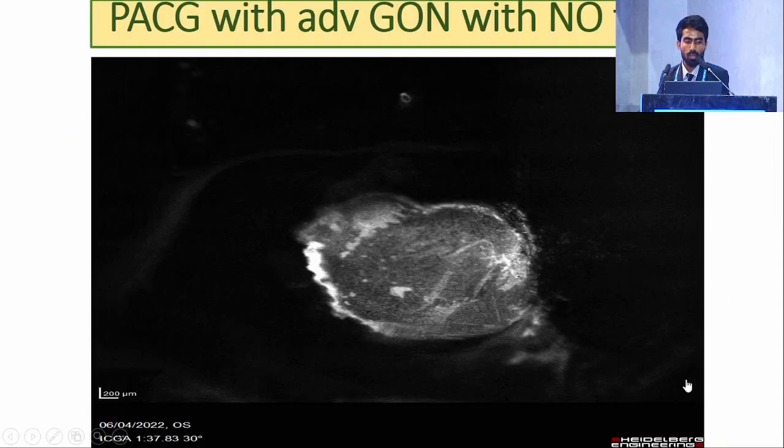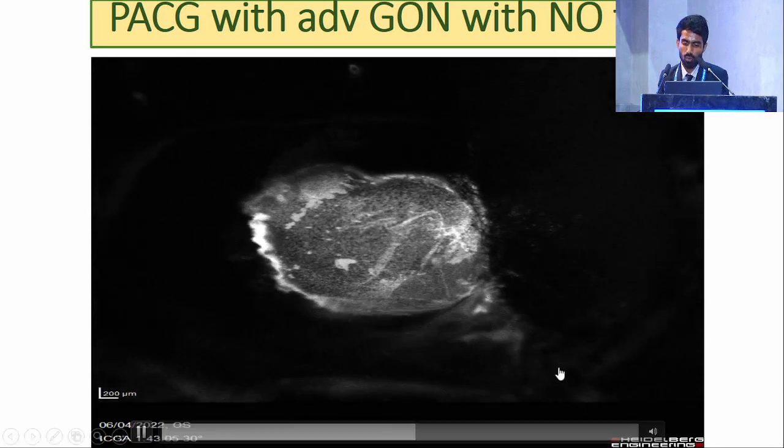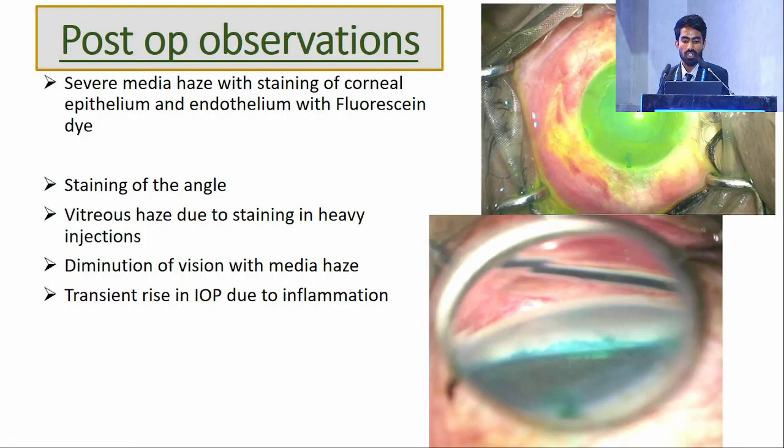This is a primary angle closure glaucoma patient with advanced glaucomatous optic neuropathy after ICG angiography. No aqueous channels are noted even at 1 to 2 minutes, and after injection of the dye, no aqueous channels are noted even at the maximum prominent time. So the observation is that in any moderate to severe glaucoma patient you can do minimally invasive glaucoma surgery, but aqueous angiography gives an ideal tool to show where to put minimally invasive stents or do goniectomy.